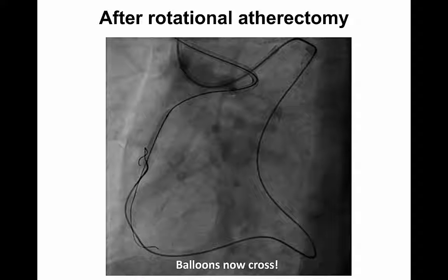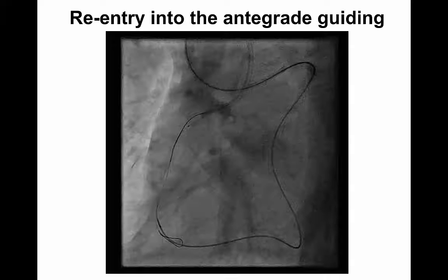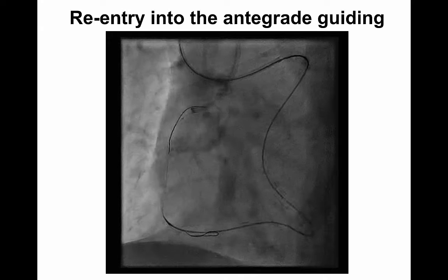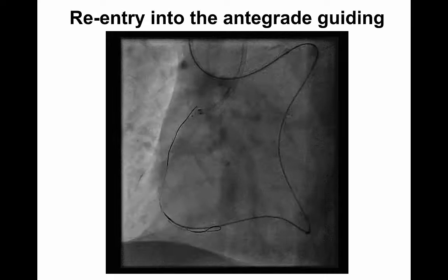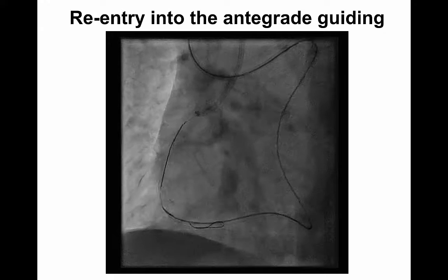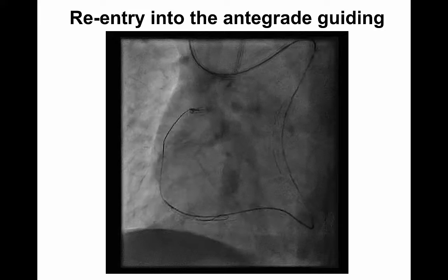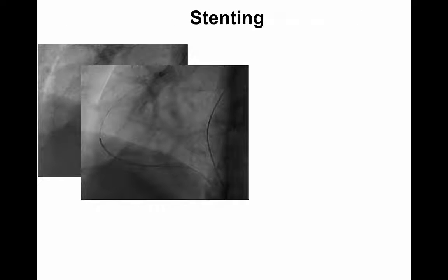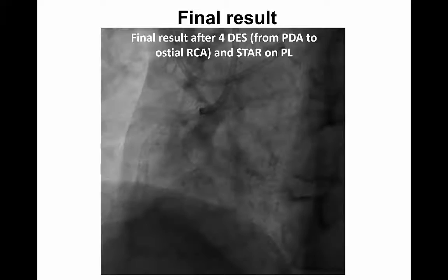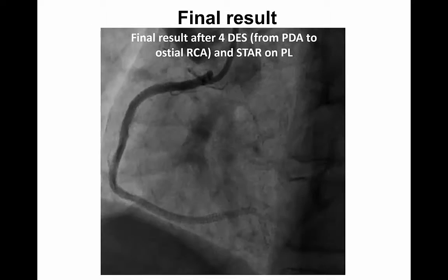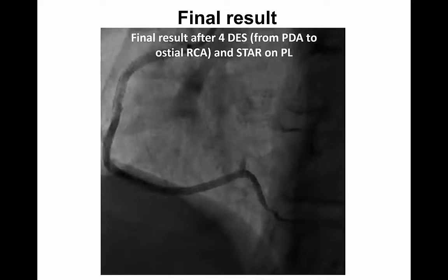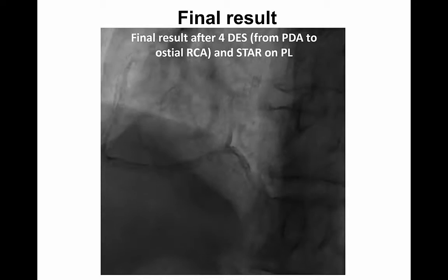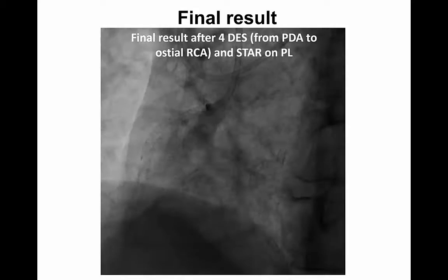The balloons now cross after having performed rotational atherectomy. We then re-entered into the antegrade guiding catheter from the retrograde side and performed conventional PCI with implantation of four drug-eluting stents from the PDA to ostial RCA. We also performed STAR on the posterolateral branch, and this is the final result.